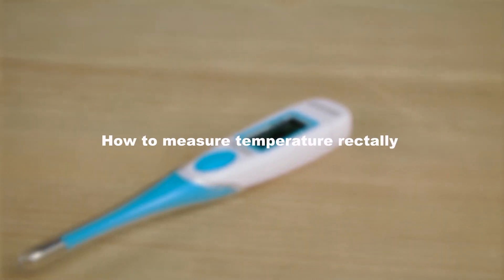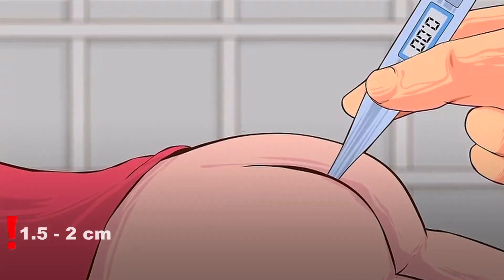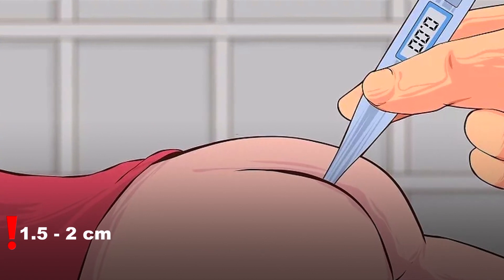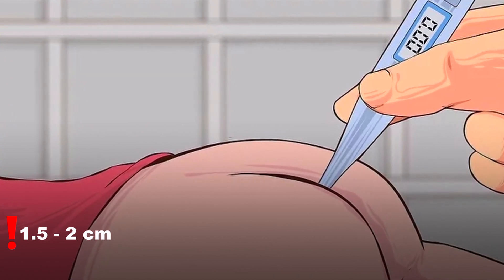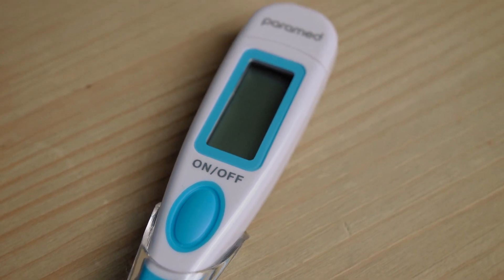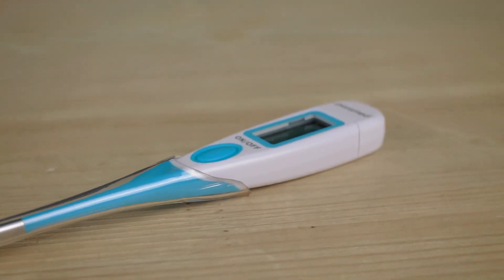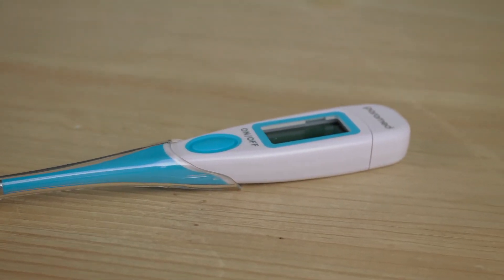How to measure temperature rectally? This method is considered the most accurate. You should place the sensor approximately 1.5 cm into the anus during temperature measurement, ensuring that the metal tip is fully inserted. The signal will notify you when the measurement is complete. Do not forget to clean the thermometer before and after use.